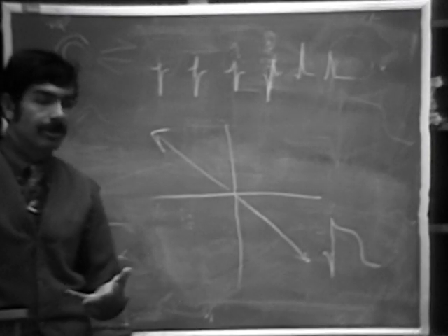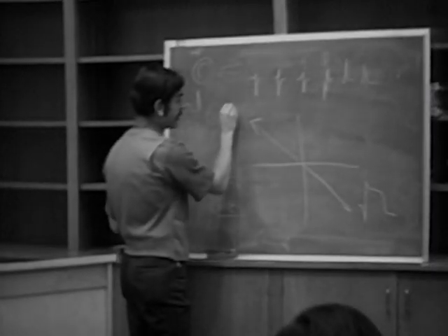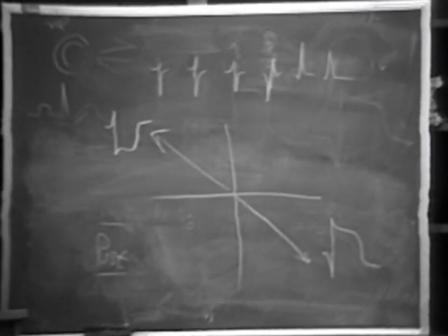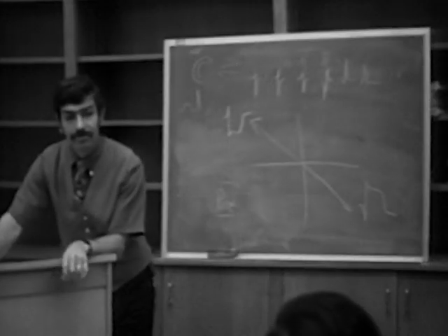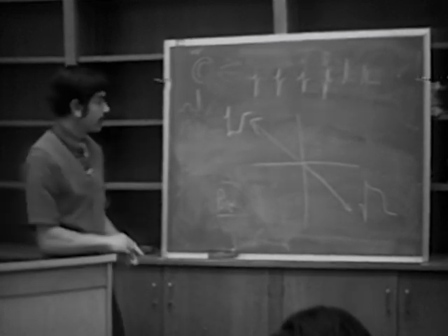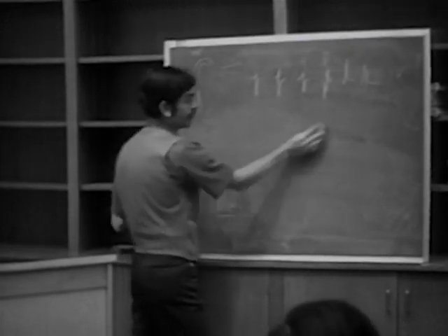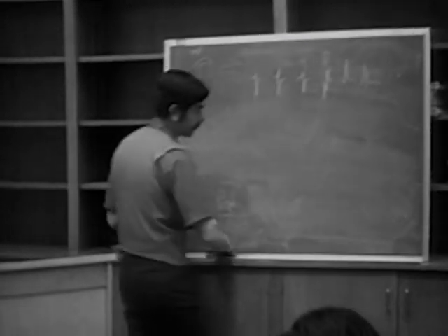Right, you get mirror image change, what they call reciprocal changes, okay? If you turn that upside down, you get something that looks like that, right? Mirror image change. Okay, this is the principle then for the diagnosis of direct posterior wall infarction. Okay, we look for mirror image changes when we're diagnosing posterior infarctions.